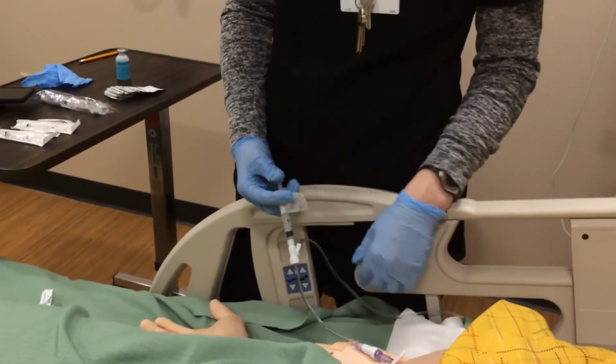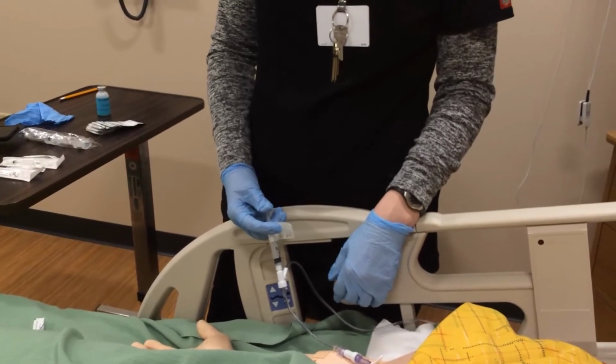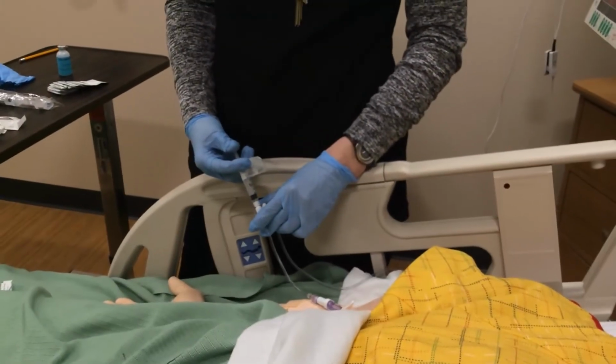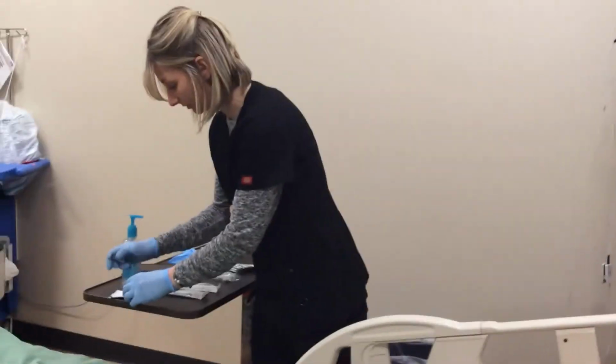Push a little bit more. Keeping an eye on my clock. We're going to say that we're at the 2 minutes. All right. So that is how you give a medication through an IV line when it's compatible.